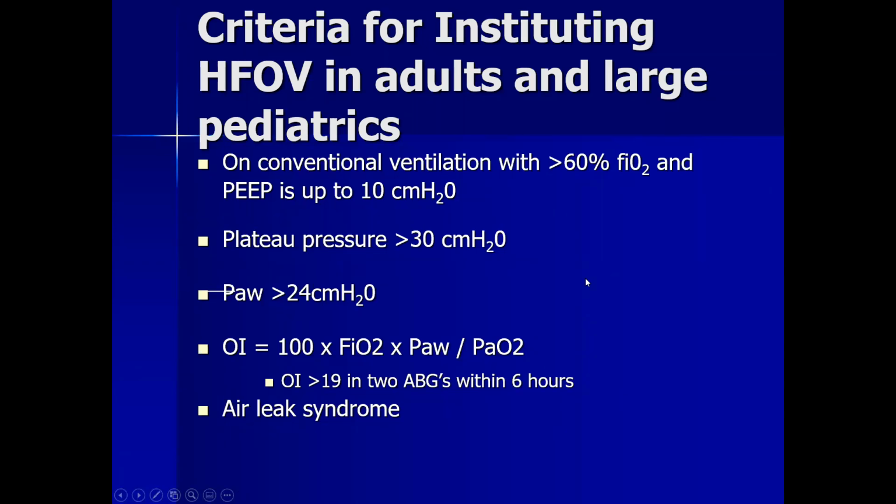So why would you recommend a patient go on an oscillator? With adults and pediatrics, there was a study that came out, it's probably going on 4 years now, saying that if patients go on an oscillator, they usually end up dying, so an oscillator shouldn't be used. And that study just cut the usage of the oscillators, and you stop seeing it. You still see it with neonates, but not with adults and pediatrics.